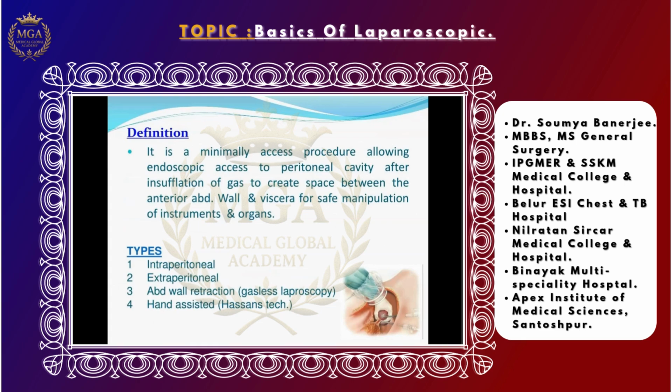So this space is basically created through the creation of the pneumoperitoneum, meaning we are insufflating gas inside the abdomen. Okay, so there is a creation of space, and that space itself helps us to manipulate or to deal with the viscera, the instruments and the organs.